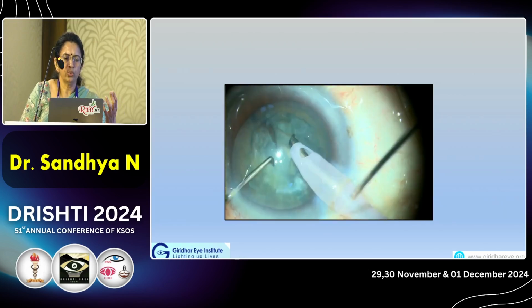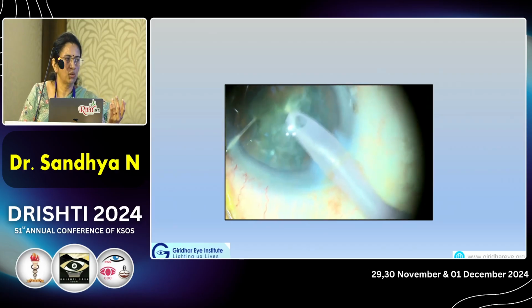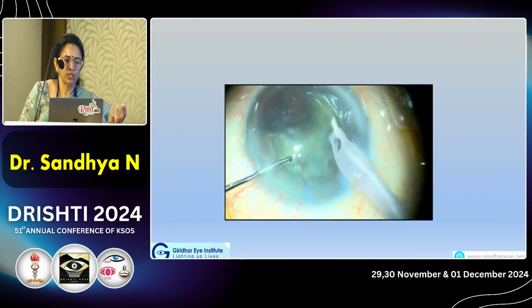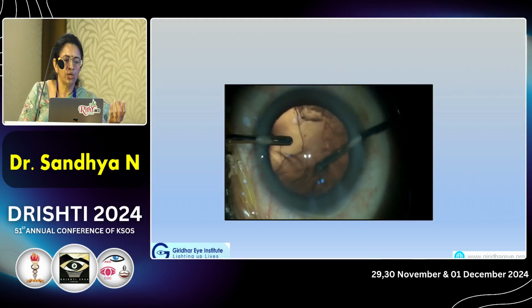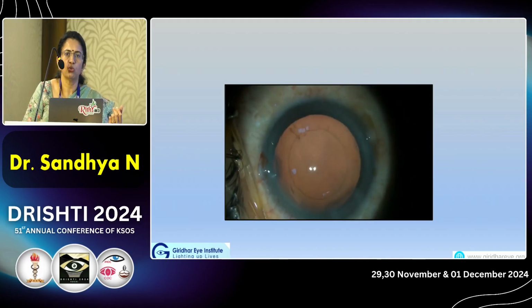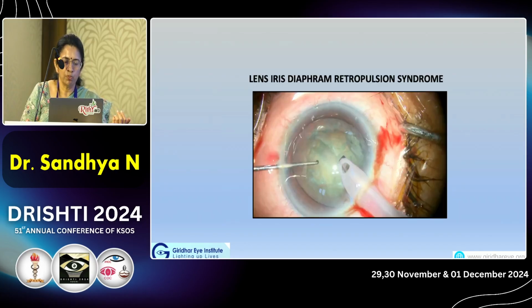And also whenever you are introducing the phaco probe into an eye that has a deep anterior chamber, that is, these long eyes, myopic eyes, you should reduce the infusion pressure so that there is no sudden deepening of the anterior chamber, which can cause pain to the patient and also can make the surgery difficult because you'll have to hold the instruments more vertically. The anterior chamber is very deep. At the end, a single piece lens was implanted.